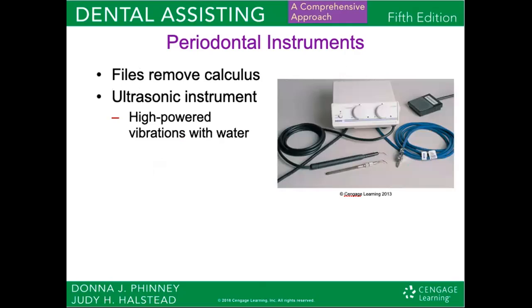The ultrasonic scaling unit is used to remove hard deposits, stains, and debris during scaling, curettage, and root planing procedures. They're used as an adjunct or an extra to manual scaling procedures. But what I found is that most hygienists and periodontists use this instrument as their workhorse, or the instrument that they use most for the heavy lifting of the dental cleaning and deep cleaning.